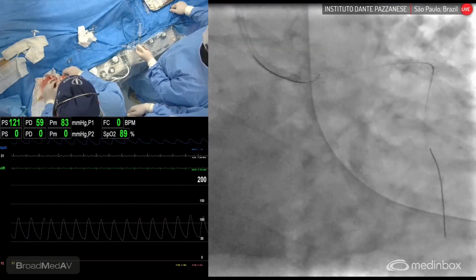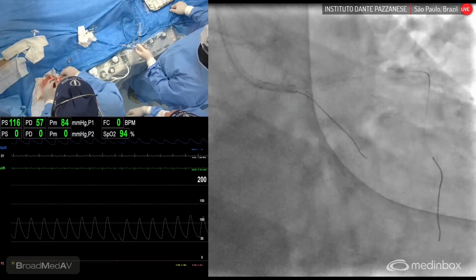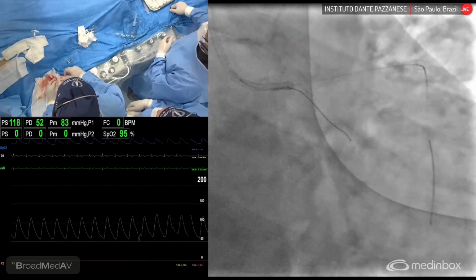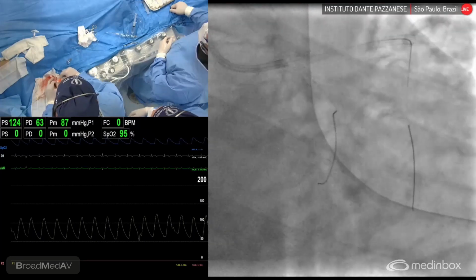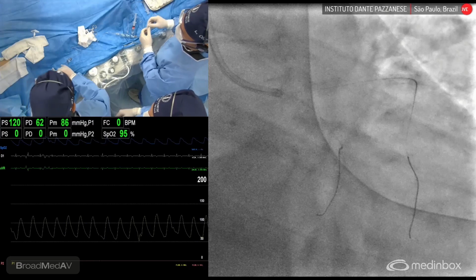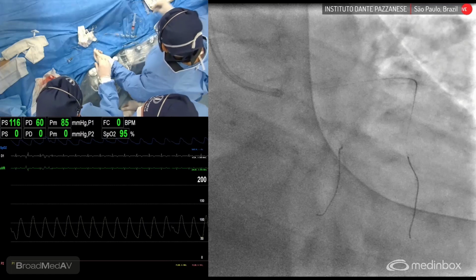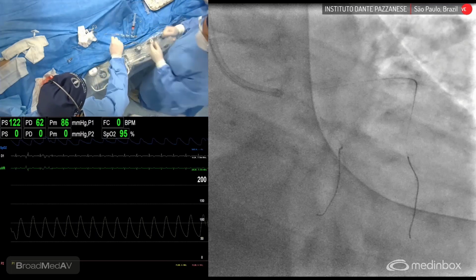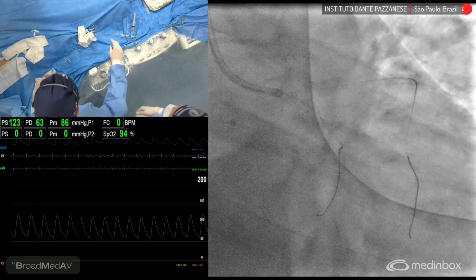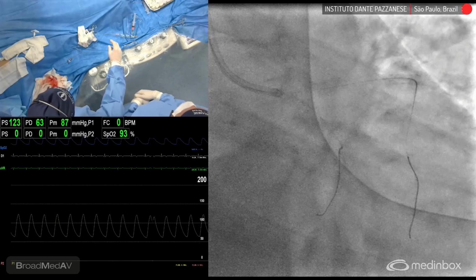Rodolfo is working. I think he's already inside, but not being able to move distally. Okay, now, very good. And the POT, of course, very helpful here. So Rodolfo, you're going to go now to do a kissing balloon. Do you think you should first open the cell with a short balloon, a 2.0 maybe, or are you confident with 2.5? I think 2.5. Okay, 2.5 balloon. I can try with the 3.5 that we have, 15. Do you want to try with a larger balloon already to do the dilatation?